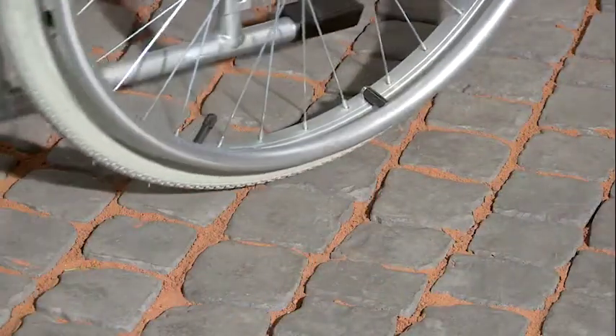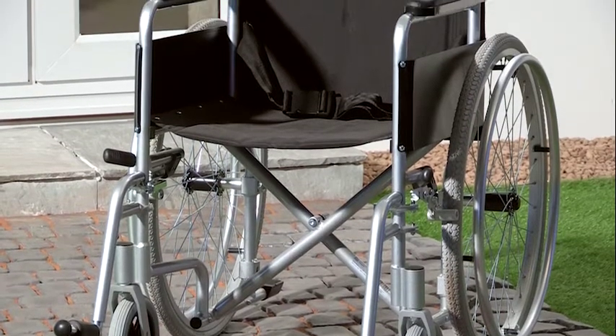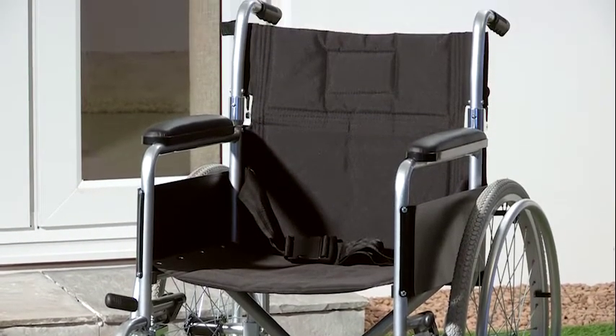Its front wheels allow excellent manoeuvrability and have solid puncture-proof tyres which are virtually maintenance-free. This Superlite wheelchair comes with our extended two-year warranty, which is a real testament to our commitment to durability and quality products that won't let you down.